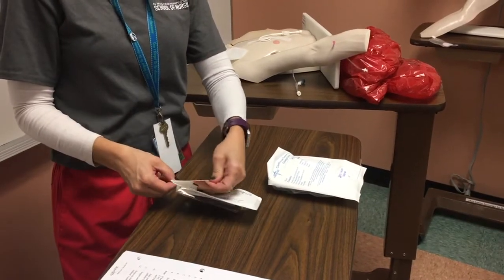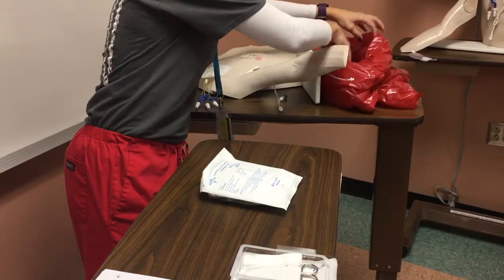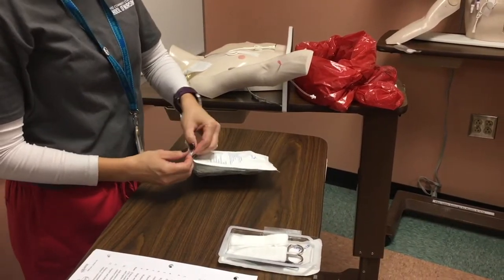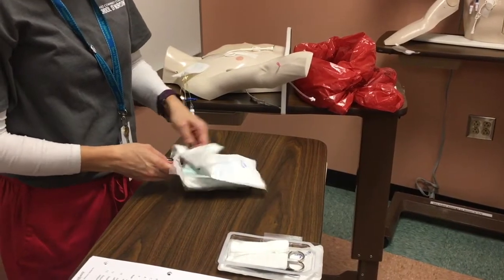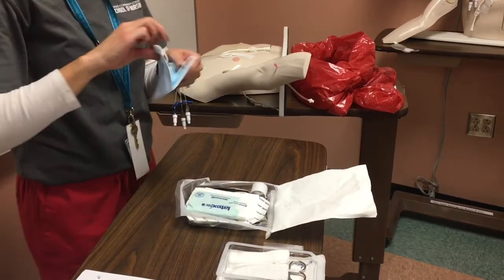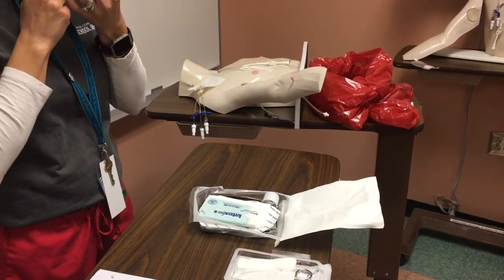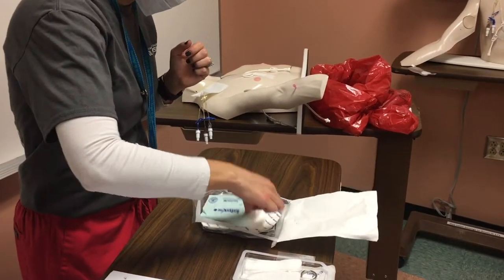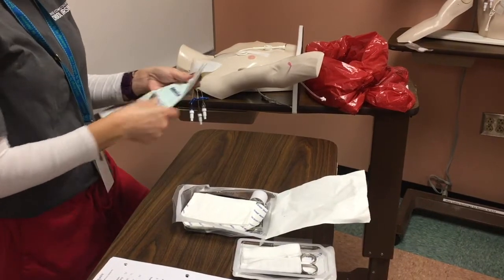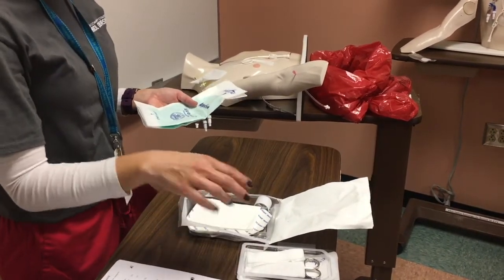I'm going to set it over here to the side. I've got my bag and I'm going to set it over right here so it's close by — once I remove the catheter I can just go ahead and put it in the bag. I'm checking my bag: it's intact, it's not expired. I'm going to take my mask out first and go ahead and put it on, then I'll take out my gloves and put these on. I don't need a Biopatch because I'm removing everything.